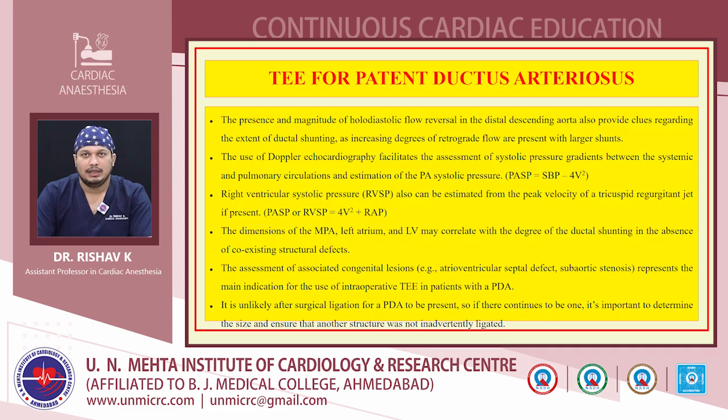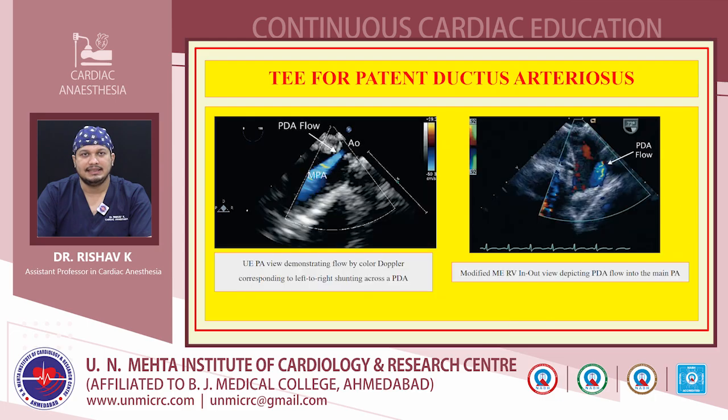Like I have already told, transthoracic echocardiography is usually more than enough in quantifying the lesion and in planning the surgical approach or transcatheter approach, but we can use TEE in patients undergoing surgical correction of these lesions in order to confirm the findings of the preoperative echocardiogram, as well as to guide the surgical team regarding management of associated lesions, and to evaluate the left and the right ventricular function as well as the valvular function. It is also unlikely, this is very rare, for a residual PDA to be present after a surgical ligation. So if there continues to be one, it's important to determine the size and to ensure that another structure was not inadvertently ligated.